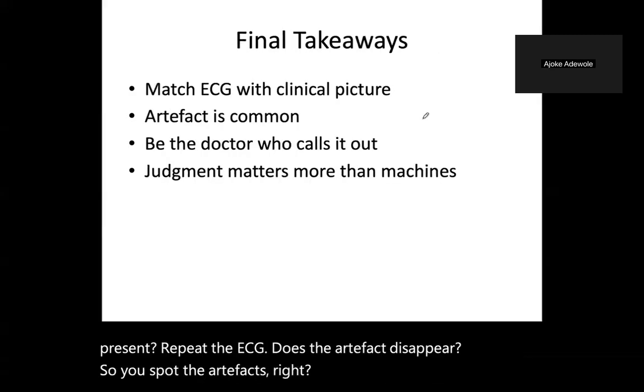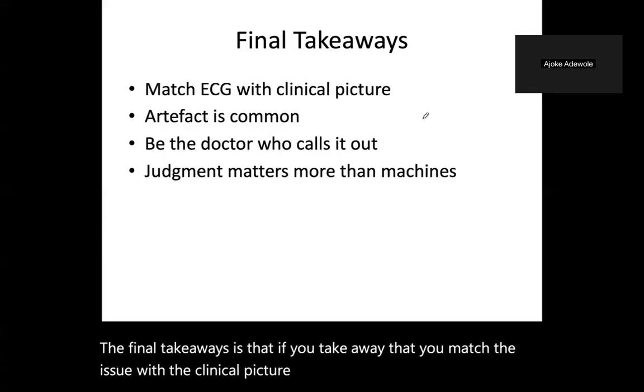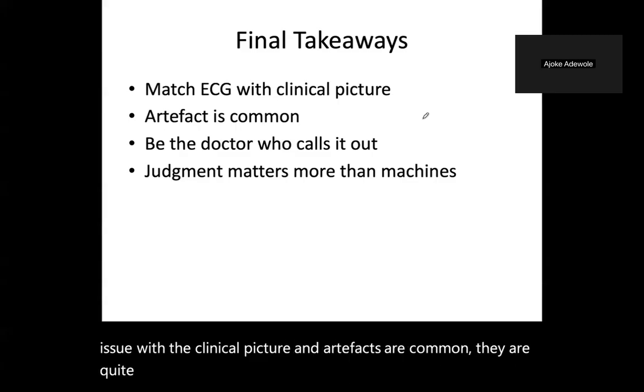The final takeaway is that you match the ECG with the clinical picture, and artifacts are common. They are quite common. Be the doctor who calls it out. Judgment matters more than the monitor.